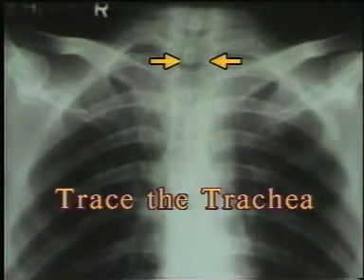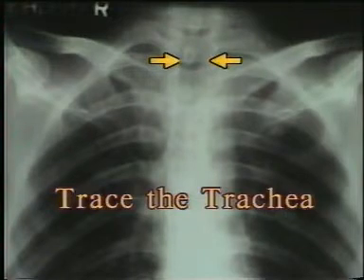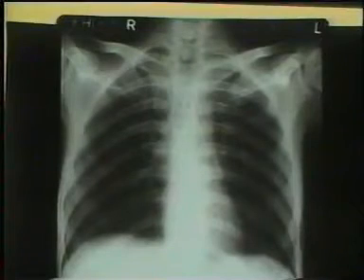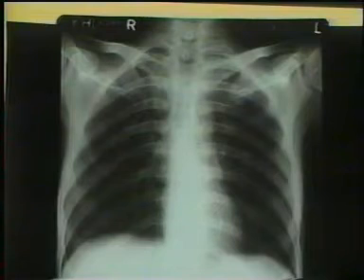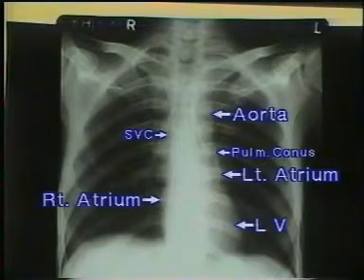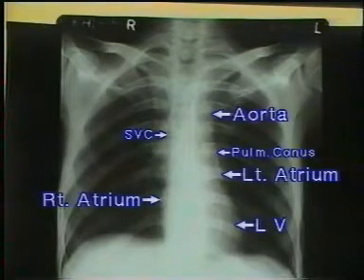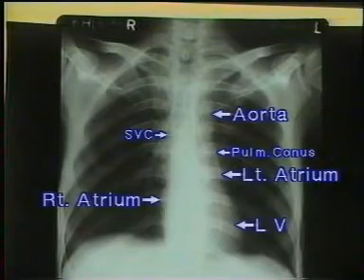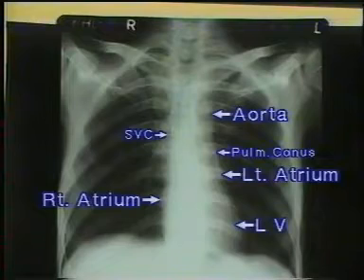This completes the inspection of the lung fields. Now inspect the cardiac silhouette. First study the cardiac border and measure the cardiothoracic ratio for cardiac enlargement. The left cardiac border is made of the aorta, pulmonary conus, left atrial appendage and the left ventricle. The right cardiac border is composed of the superior vena cava and the right atrium.